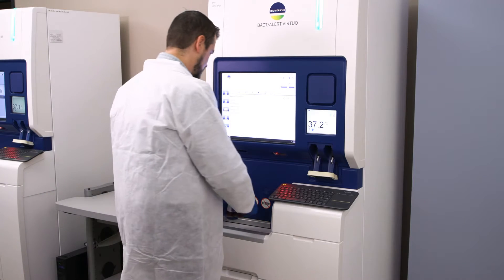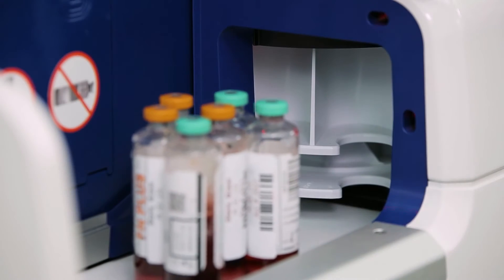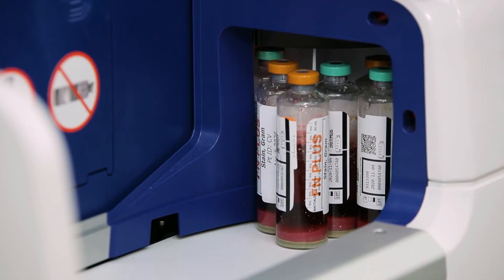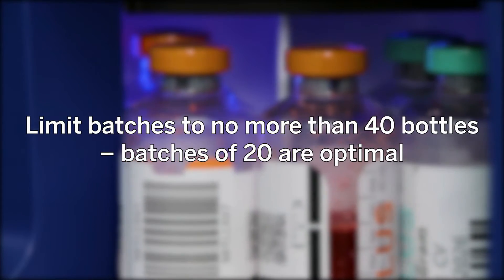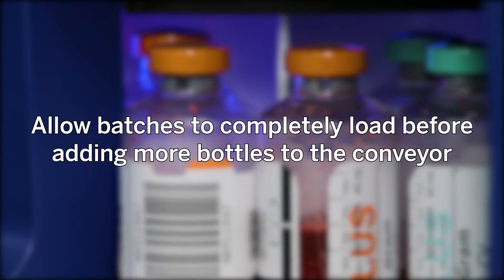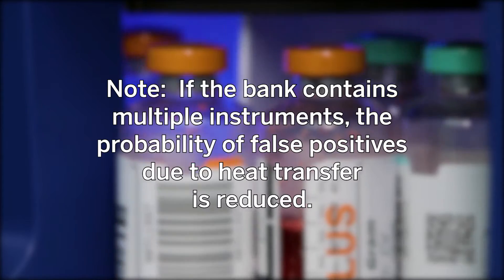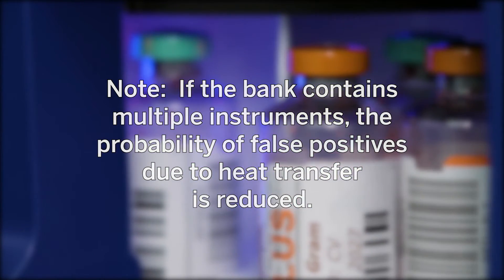Place bottles upright on the conveyor belt in the bottle loading area. Adhering to the following recommendations will reduce the possible negative effects of temperature on organism growth conditions and the occurrence of false positives. Limit batches to no more than 40 bottles; batches of 20 are optimal. Allow batches to completely load before adding more bottles to the conveyor. Avoid loading over 70 bottles within one hour. Note: if the bank contains multiple instruments, the probability of false positives due to heat transfer is reduced.